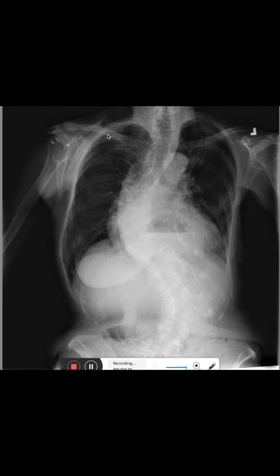Let's first have a look at the lungs. In the lungs we see they're homogenously transparent, we don't have any focal consolidations, so no infiltrates. We also see that the margins of the diaphragm are sharp, so the patient does not have a pleural effusion.